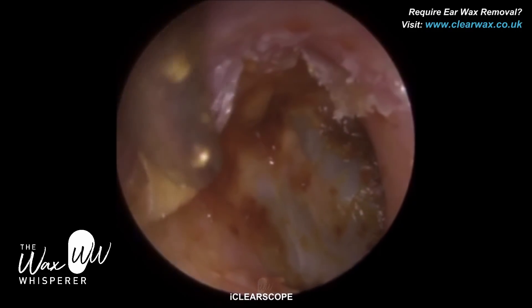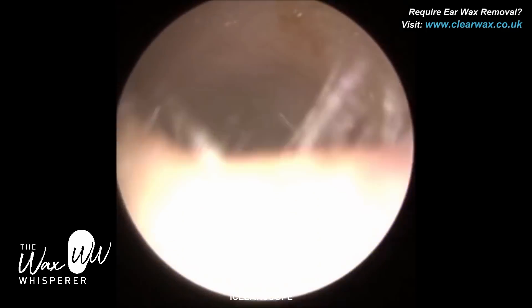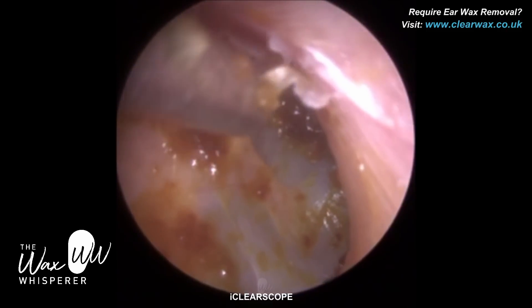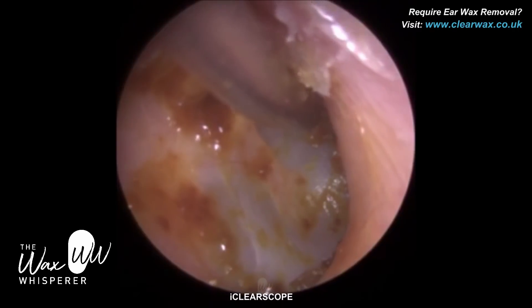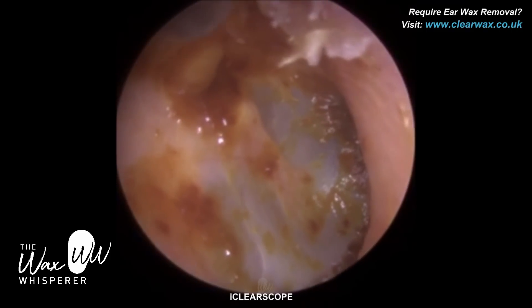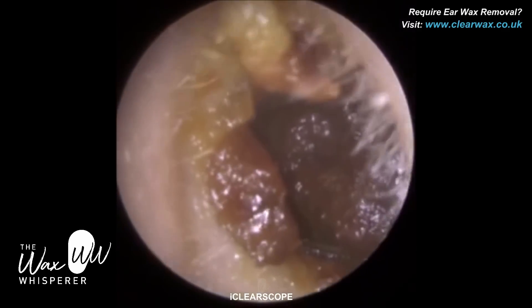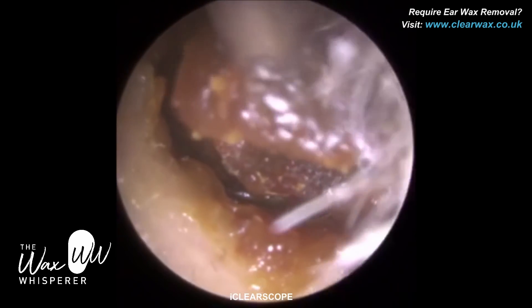So just some dead keratin around the ear — I'm just gently peeling. I hope that video was a great illustration of the differences between endoscopes. The other endoscope, I believe at the time, was not autoclavable. Autoclavable means you can disinfect or sterilise the endoscope using steam in a special steam chamber — normally at around 134 degrees centigrade. With our device, the iClearScope, between patients we don't autoclave it — it's a long process. Instead, we use a high-level chlorine dioxide disinfectant system, and that's part of our user guide — we've had all the compatibility tested.